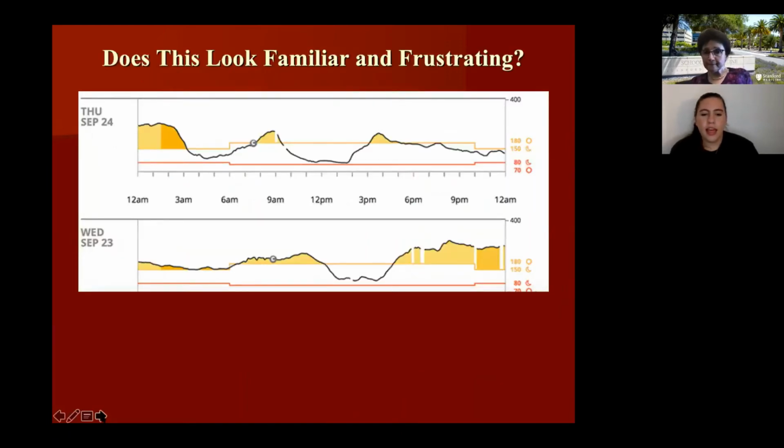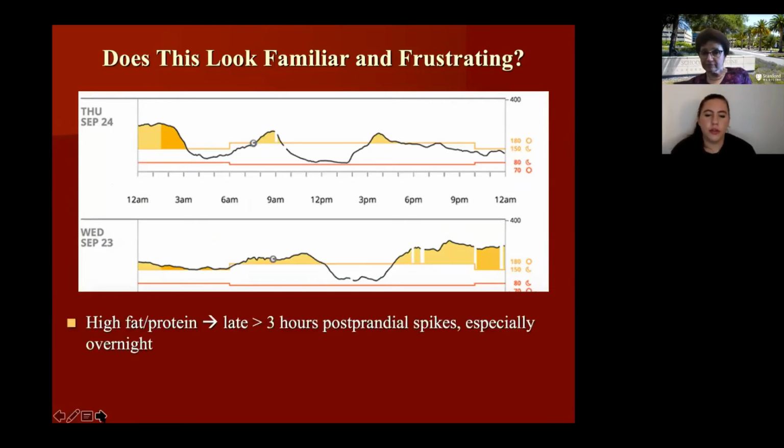Dr. Basina, how does the super bolus work with the Control IQ when you can't reduce basals? You cannot reduce basals, but you can set your exercise mode. So your exercise mode will use your target as 140 to 160 instead of your 110 to 120. Okay. Right, yeah. And the same thing for Medtronic, you can set your temp target as 150. Okay.